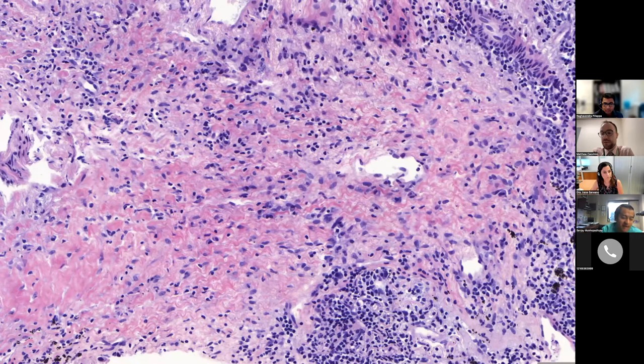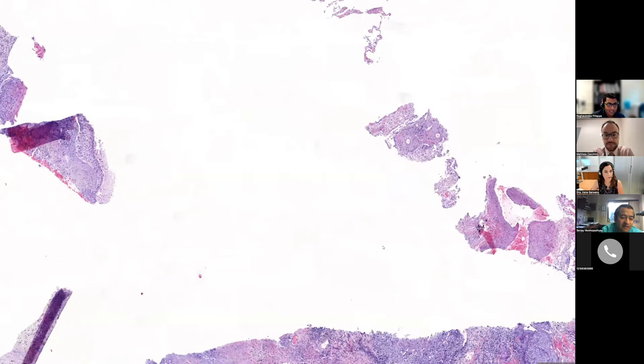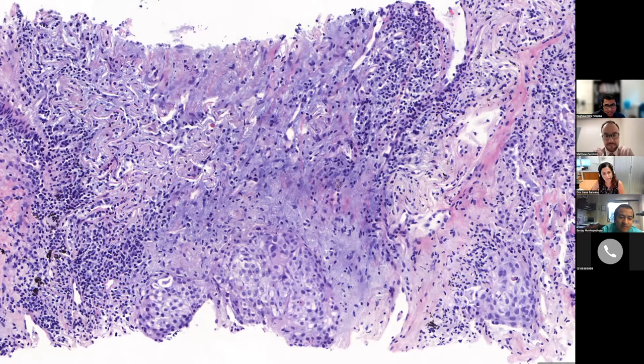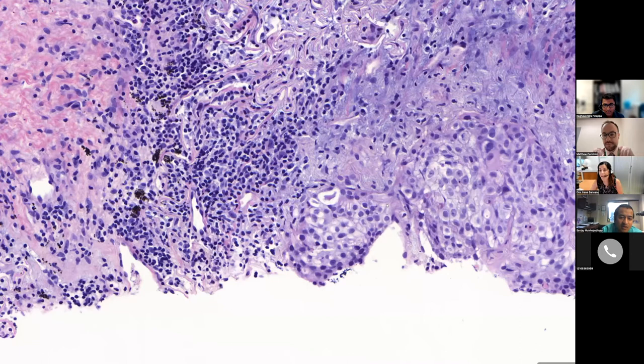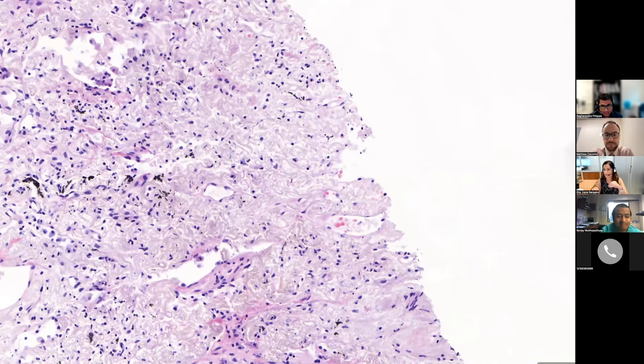So Raghav, take me to where you said it was. I think the basophilic areas right here. Here? Yeah, stop right there. Are those lymphocytes, or is this a vessel? The background was a little funny looking because it has more elastosis. I think we are in the apical cap, the stroma. Yes, here we are in the apical cap. And maybe the carcinoma has appeared there.